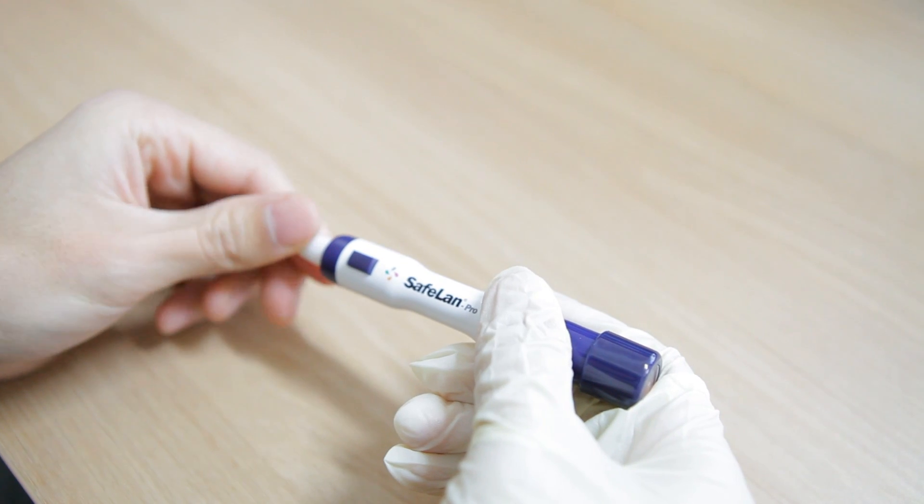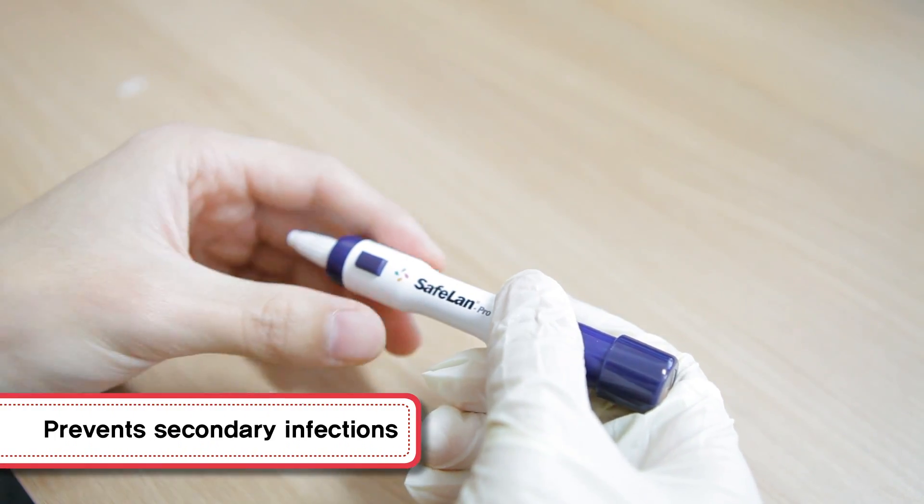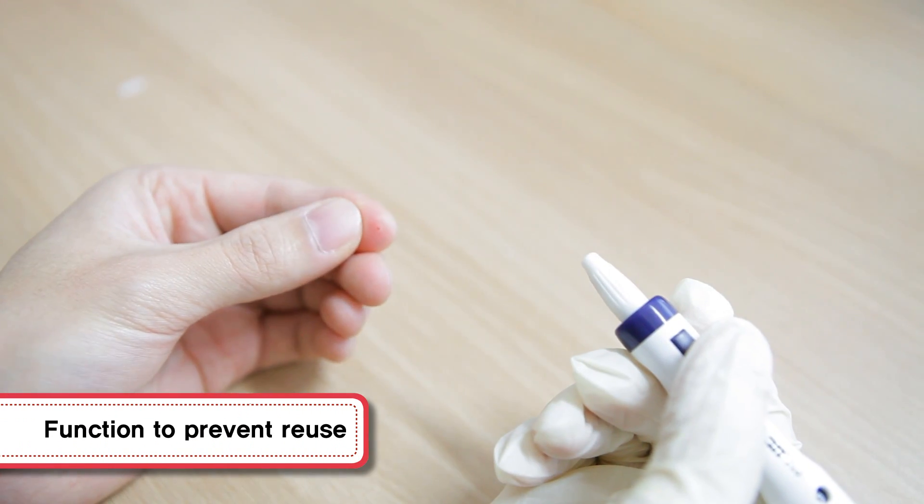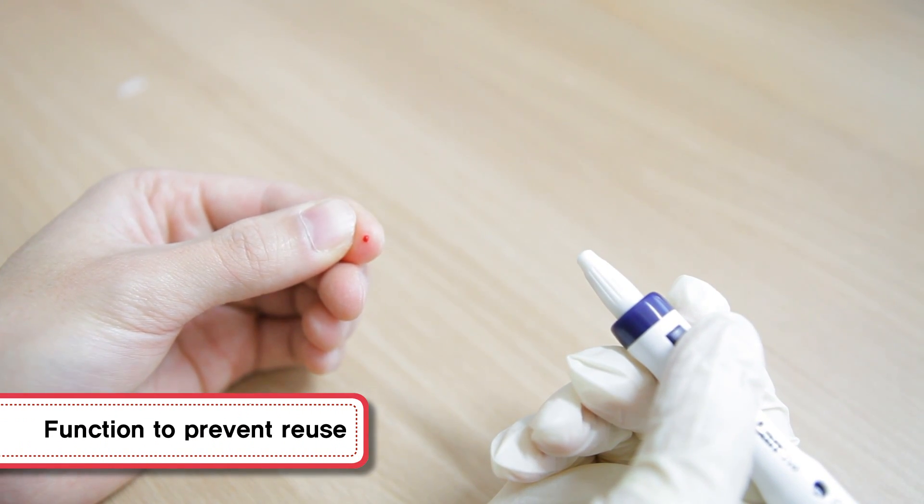By designing the protective cap to be discarded after use, it prevents secondary infections from bloodstains because it stops the re-usage of disposable lancets.